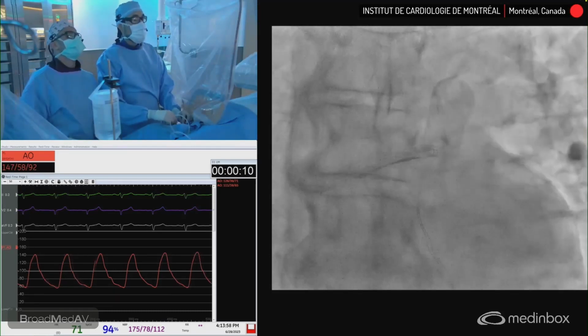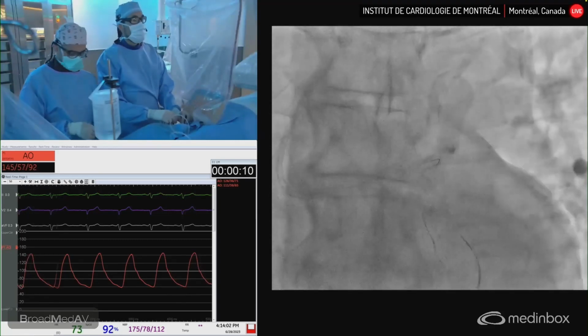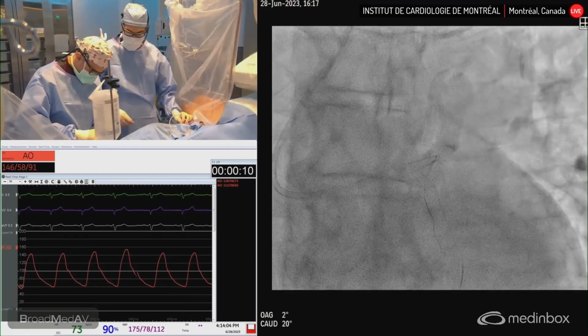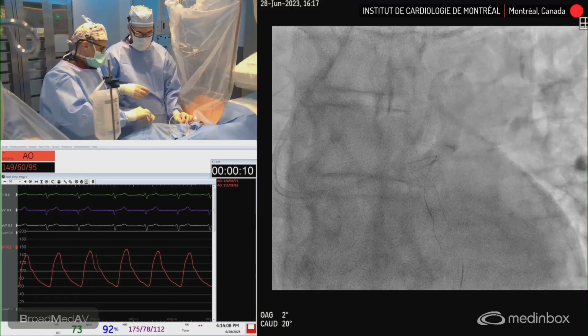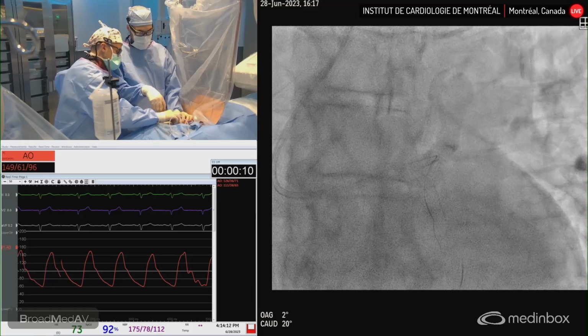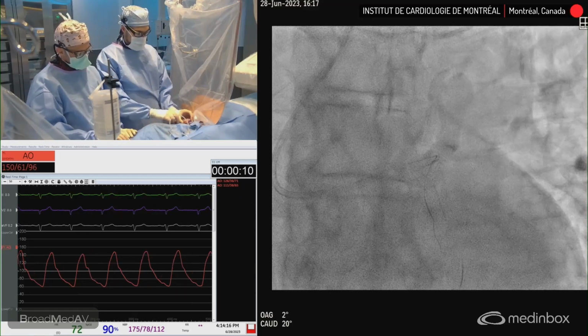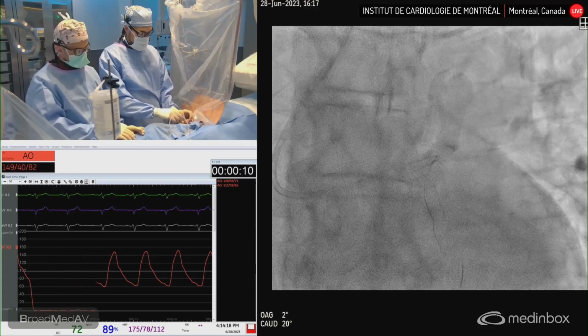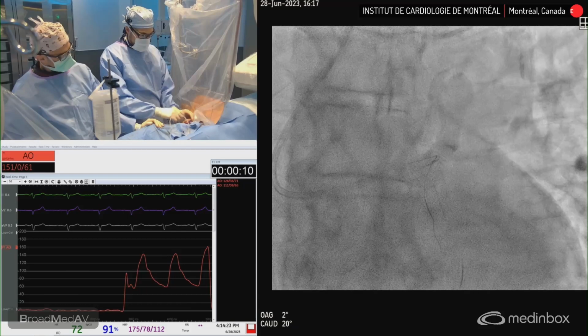Okay, push the wire. Is that the wire from? Yeah, yes, sir. It's okay. Okay, push that. Okay. Like I say, better be lucky and good than bad lucky and not good. That's good. So let's go straight. We'll go through all the stent, eh? Yeah, we see it. We're going to image the whole stent. I'm waiting a little because it's not.